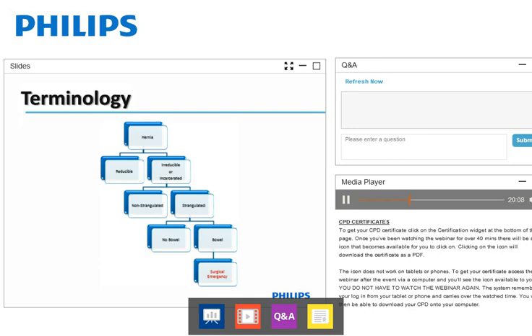Now, obviously, if there is bowel involved in that strangulated piece of tissue, then that can become a surgical emergency because we don't want the patient to perforate and get peritonitis and all the complications that result from that. And that's, in fact, one of the main reasons why we perform a hernia ultrasound: to establish if bowel is involved or if there is any strangulation of that bowel, because that is going to dictate the immediate management of the patient. So just once again, some of the terms you need to try and remember.